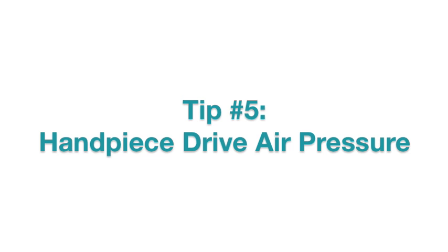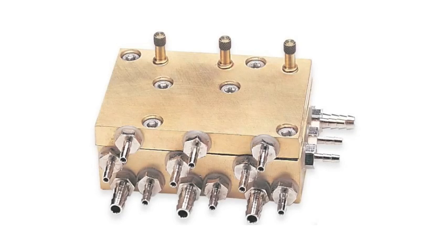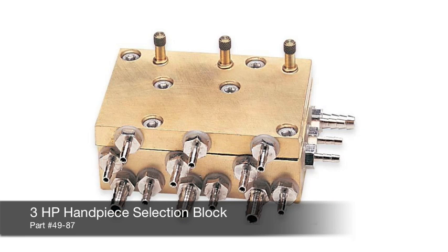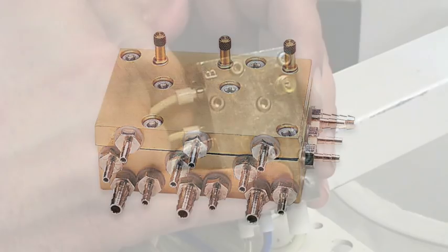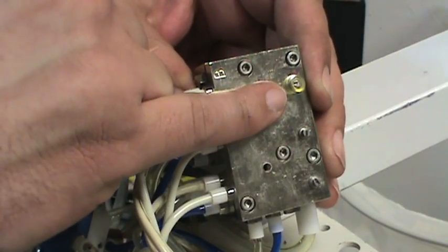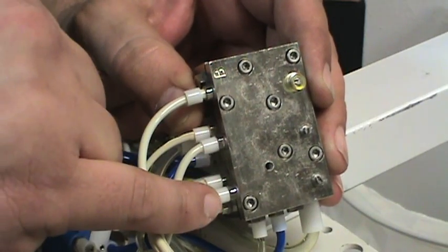Manufacturers typically suggest that you have the drive air pressure set at 30 pounds per square inch. On most units you would set your drive air pressure on the handpiece selection block similar to the block pictured here. Normally anything in excess of 40 PSI would only cause damage to the turbine without increasing performance.